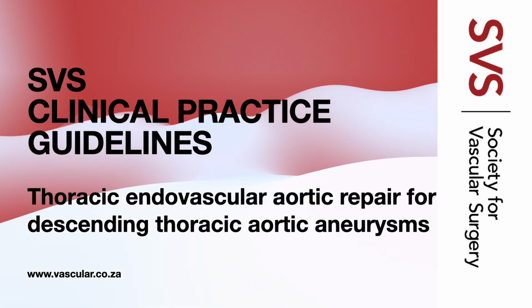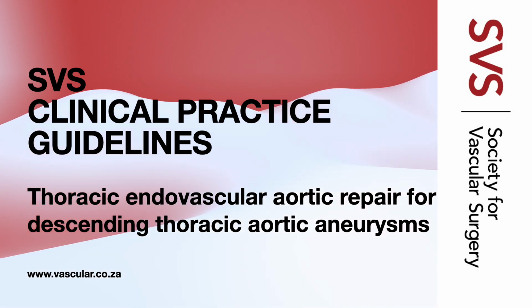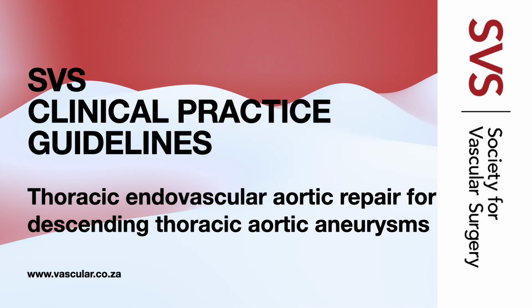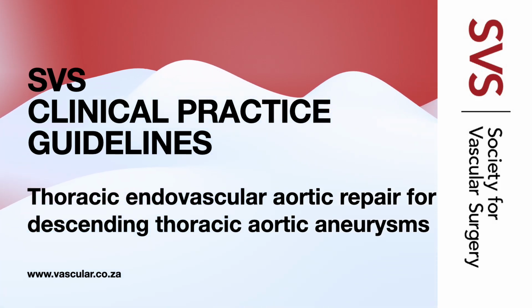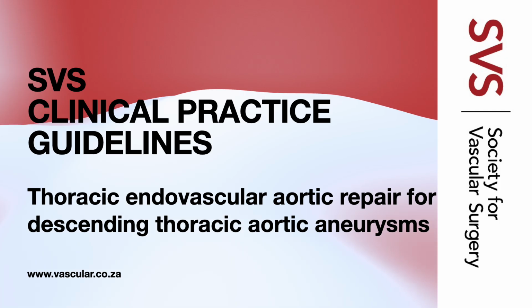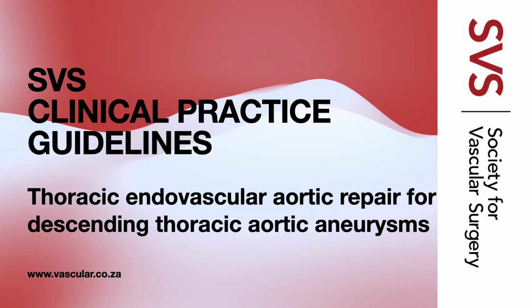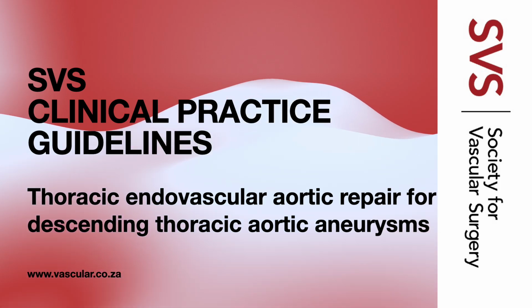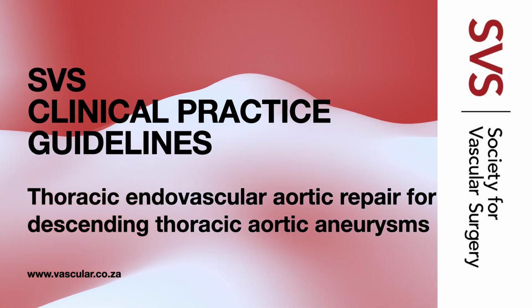Makes sense. Plan carefully. But, and this is really important, the imaging after the procedure is just as vital. So, follow-up. Yes. Regular CTA scans are usually recommended, typically at 1 month post-procedure, then 12 months, and after that, yearly. For life. Really? For life? Wow. Yeah, it's basically like essential long-term maintenance checks for the repair. We need to monitor it, make sure everything's okay, and catch any potential issues early, like something called an endoleak. Endoleak, what's that? That's where blood might still be leaking around the stent graft and getting into the original aneurysm sac. We need to know if that's happening. I see. So the surveillance is key.